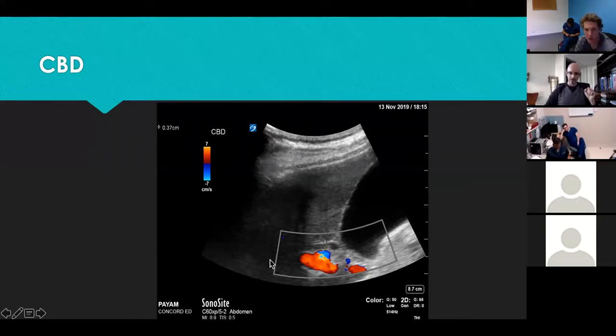So it's also interesting to see that you've got the scale right the way down at 7 on there as well. So that will make it light up. Yeah. Because if you increase the scale, technically we can actually make the aorta look like there is no flow in it if you increase the scale enough. So you put the scale down, you increase the gain enough to get the flow in the portal vein.